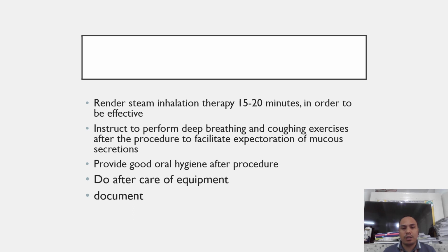Render steam inhalation therapy for 15 to 20 minutes in order to be effective. And also we need to instruct the client to perform deep breathing and coughing exercises after the procedure to facilitate expectoration of the mucus secretions. We also need to provide good oral hygiene after the procedure, do the aftercare of the equipment, and lastly document the activities that were given.